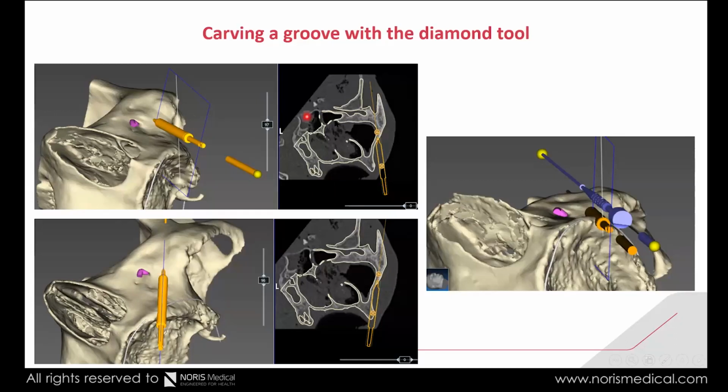Okay, what we see here is the maxilla, where we have the diamond positioned, and this is the orbital angle. This is the pencil mark that we put on the ridge. This is how it looks from the side. This is an isometric view. What we see here is the diamond. Let's say we took the point that I showed in the previous slide. We put a point here. It's a checking point, not the final point. We put the diamond on this point, and we move it down this way.